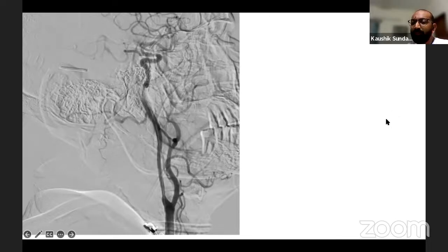Dr. Vishal, maybe you can go back to this MR angiogram when you're going back to the hospital tomorrow for this patient, and look into those axial cuts and see if there is any thrombus that you can identify within the carotid. I'm not sure whether we can reproduce this hot carotid sign on MRI. That's the question. Is there a difference between an acute thrombus and a chronic thrombus on MRI? Can we see that? I don't know the answer to the question.